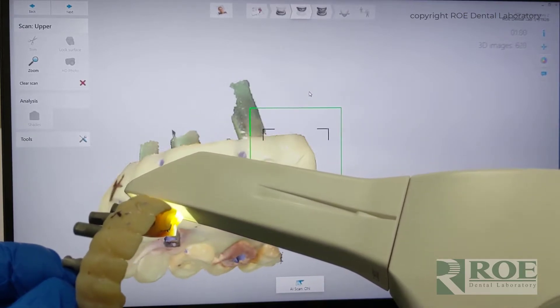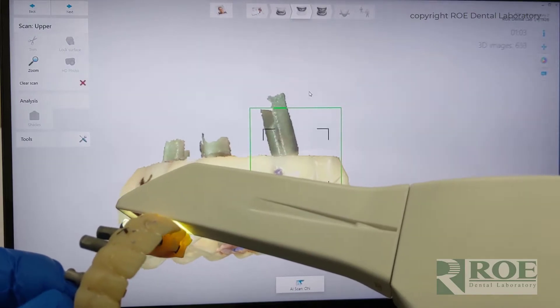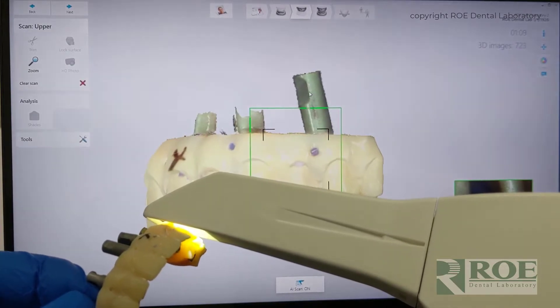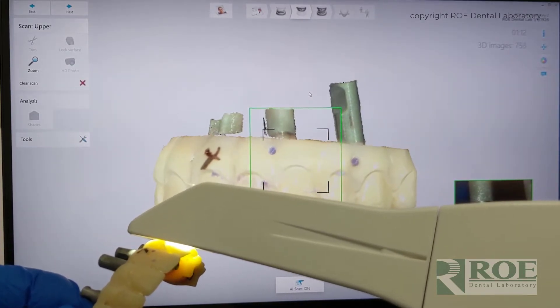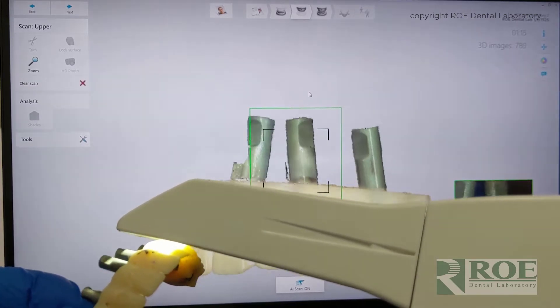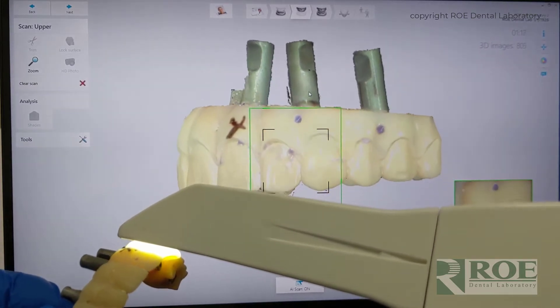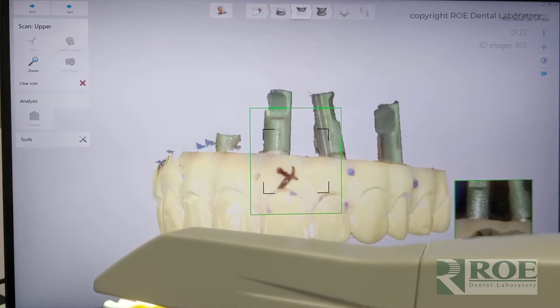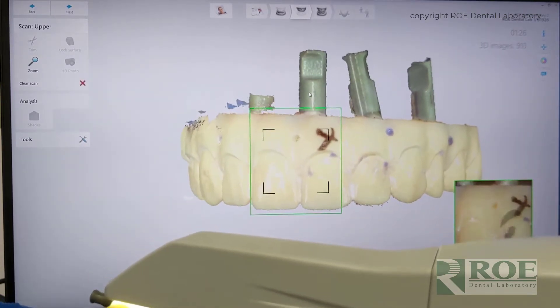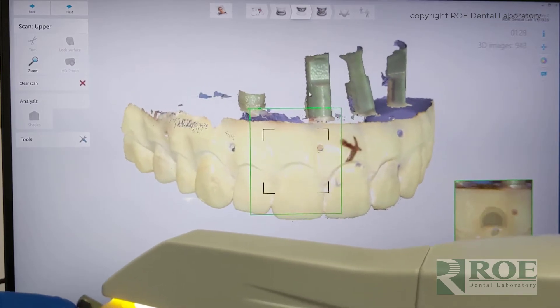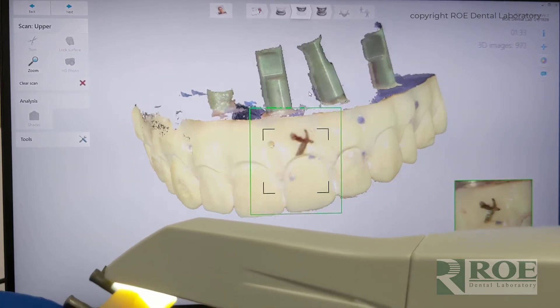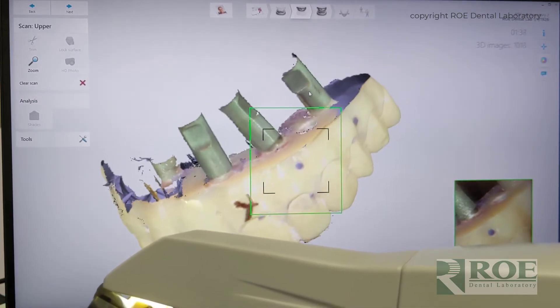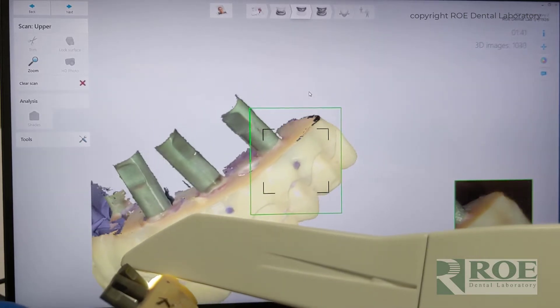Here's the trick: try not to scan more than one scan body at a time within the field of view. Scan one at a time. You see the green box? Lift it up and scan that analog. It's okay if you catch another one and it works, but sometimes it'll mistake one scan analog for another and you'll get a double scan, which can be a real problem. So I'm going to keep scanning this side and come around to the other side in a minute, trying to finish most of this side first.